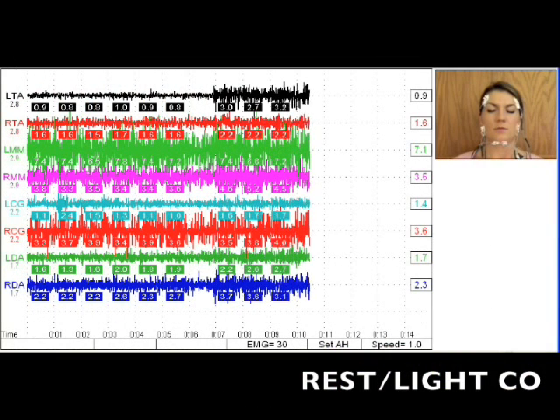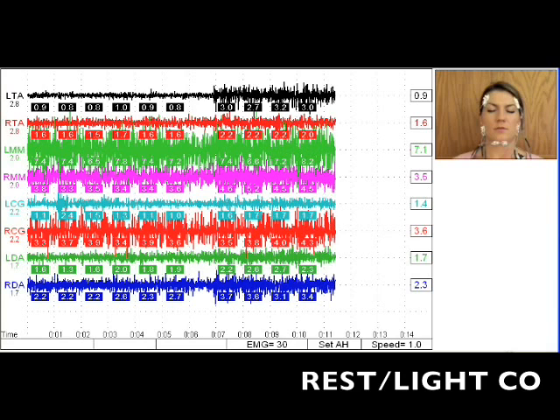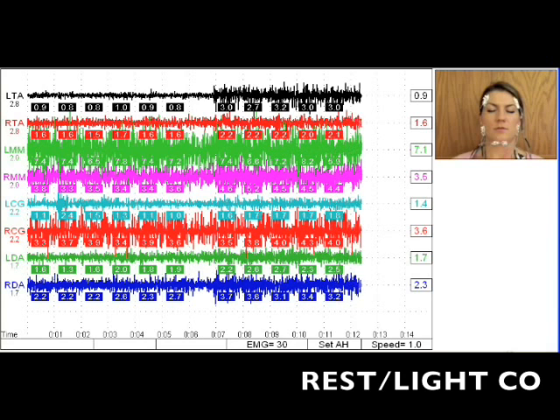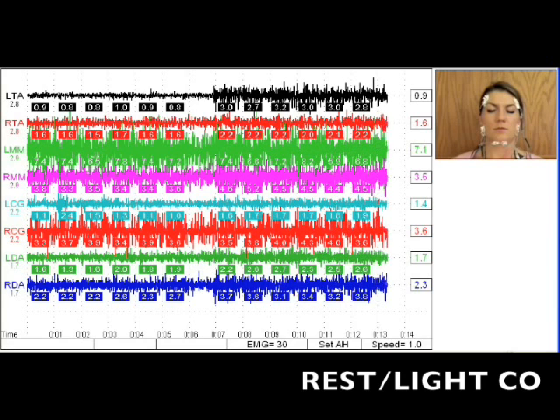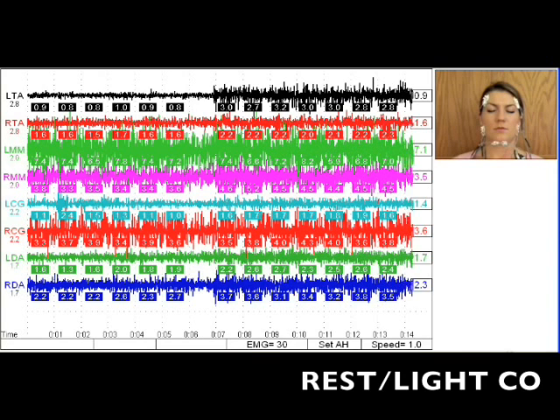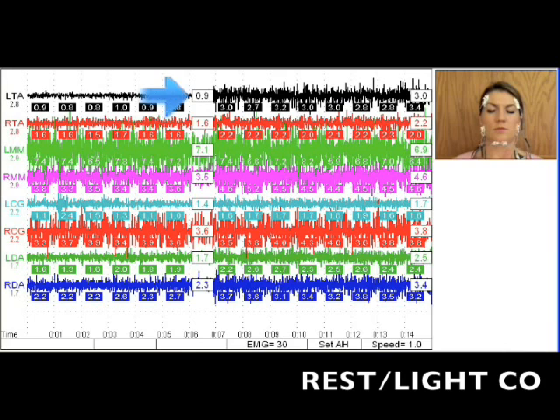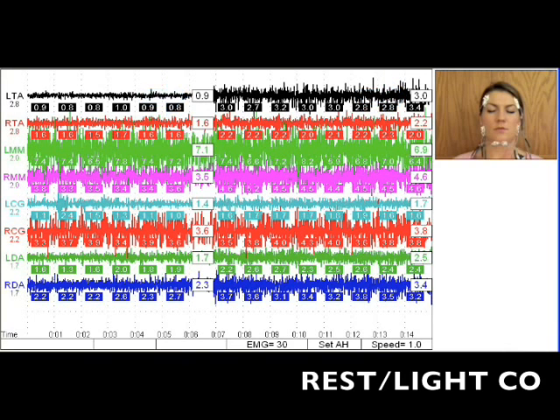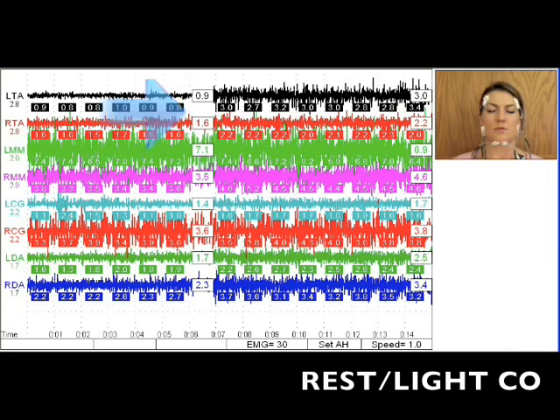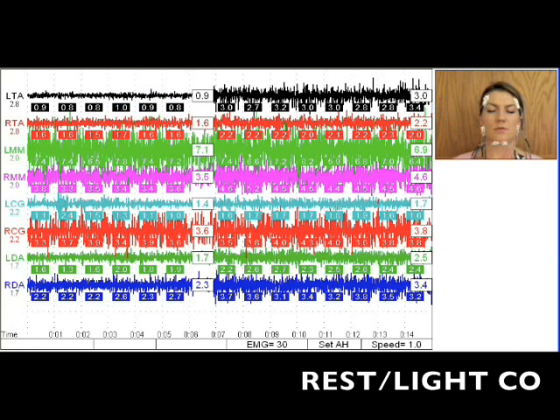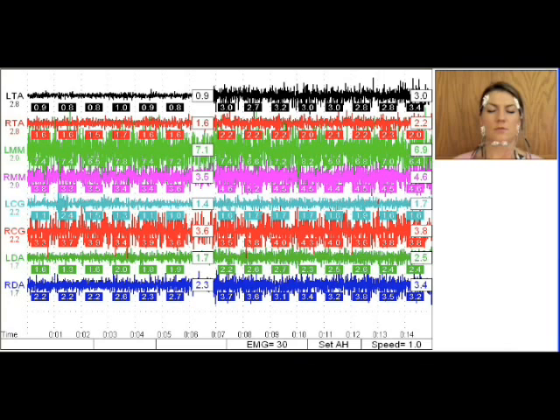Let the tracing sweep to the end of the screen where it will automatically stop. The resting EMG values will be displayed on the screen, as well as the values for the LightCO EMGs. Comparing the temporalis anterior resting EMGs versus the temporalis anterior LightCO EMGs provides you with valuable diagnostic information.